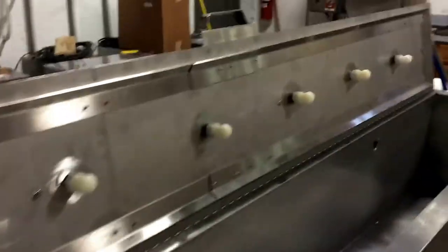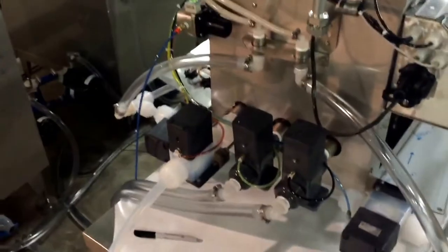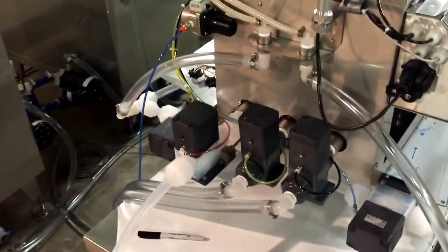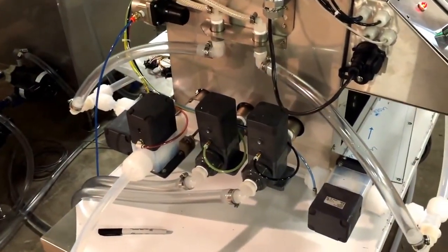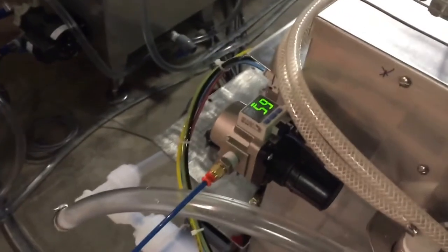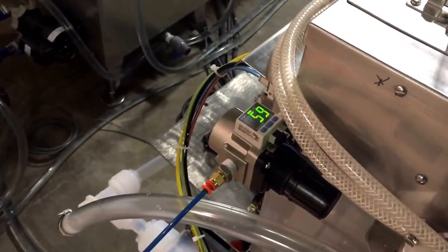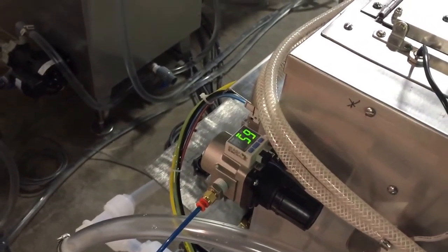Teflon pneumatic valves are used for the alkaline and acid tanks, and regular CPVC pneumatic valves are used for the rinses. There is a PLC-controlled air regulator to ensure all solenoid valves have proper high and low pressure limits, so there are no pressure-related failures — all of this is monitored.